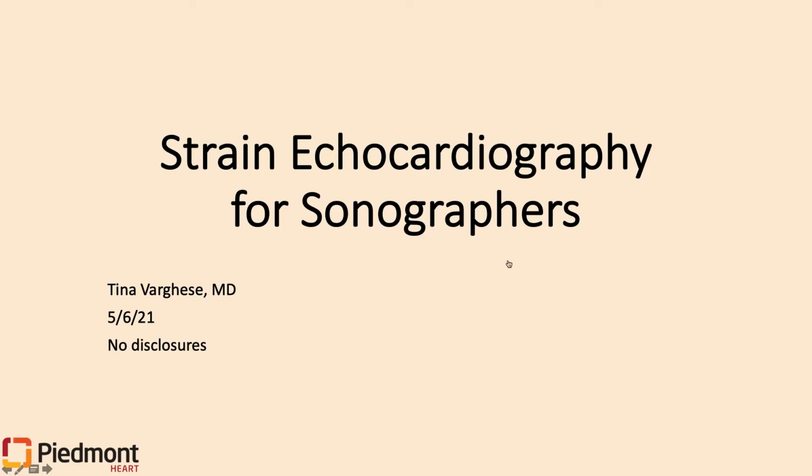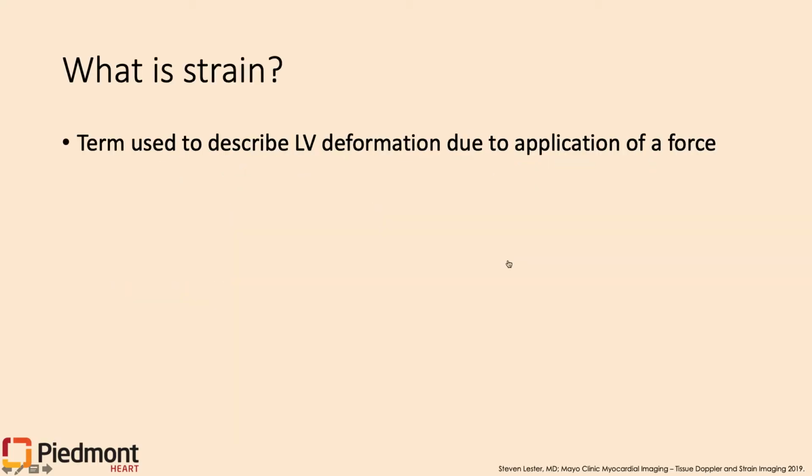I'm one of the general cardiologists at Piedmont Atlanta, and today I'm going to spend a few minutes discussing strain echocardiography for our sonographers. Our Piedmont Strain Task Force met recently, decided on a strain acquisition protocol that we'd like to implement throughout our Piedmont sites, and we will be reviewing that right now. Let's start with a review of strain.